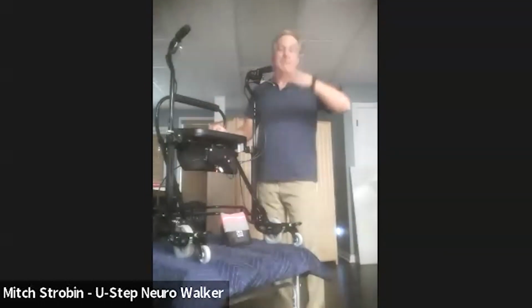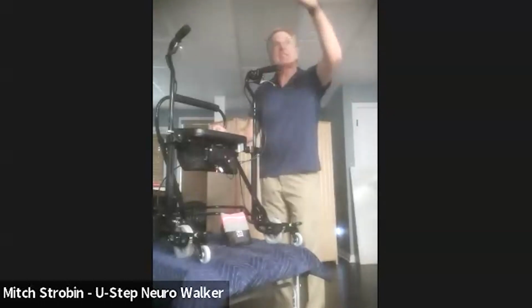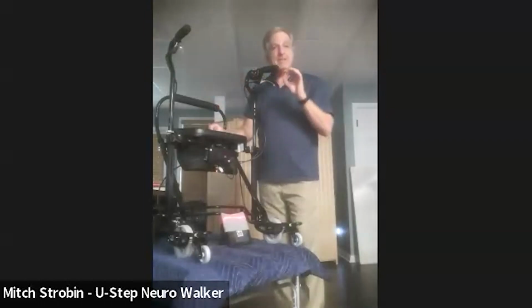There are 2 black buttons next to the red button. The top black button, every time you push it, increases the number of clicks by 1, 4 to 5, 6, 7, and then cycles back to 1. The bottom black button affects the volume of the clicking, and we'll hear that soon. So it's also 7 levels of volume from low to higher volume. Same thing, every time you push the bottom button, it increases the volume and then cycles back around.